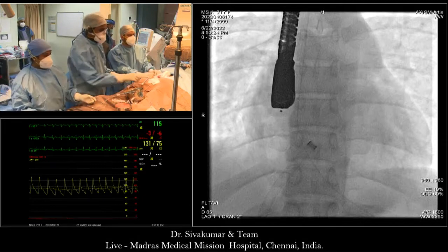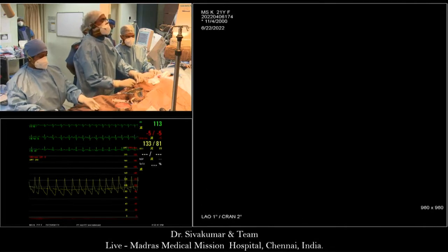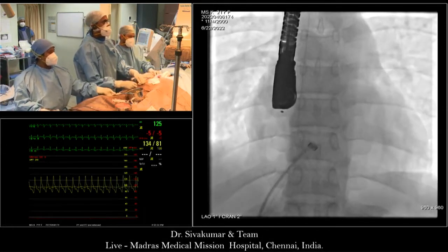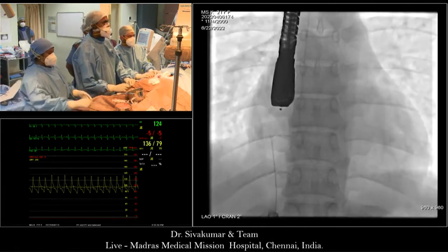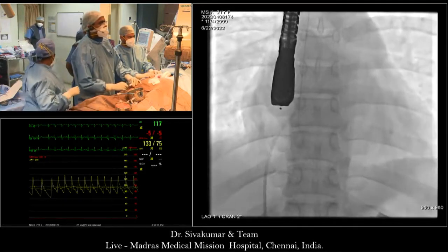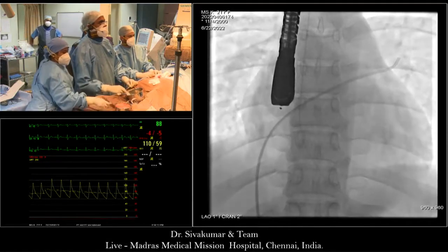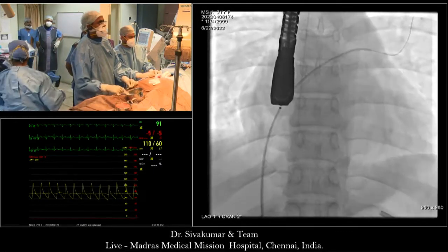I think I can try to answer the question. Yes, it can, because remember you have device sizes from 4 through 40, for example, and the thickness of the wire has to change. Otherwise, a 40 device made with the same wire as a 4 would be like spaghetti. So wire thickness increases at certain device sizes, and other devices change wire thickness at different diameters. So yes, it can make a difference. Yes, theoretically, you could be right.